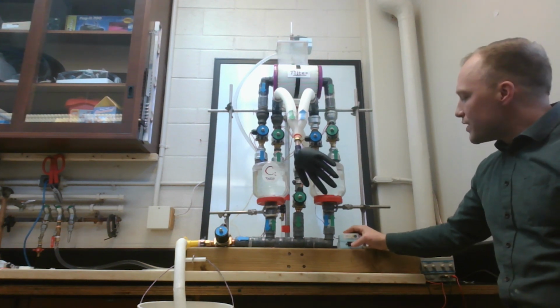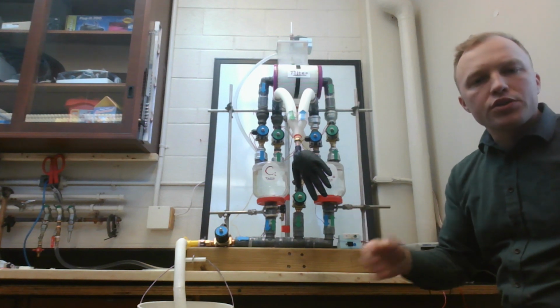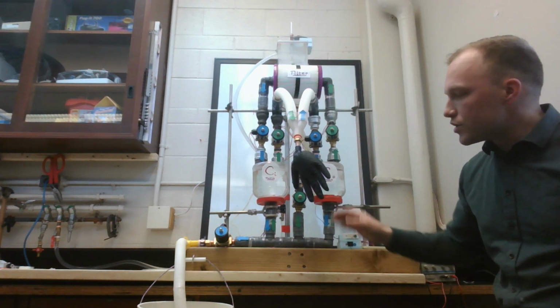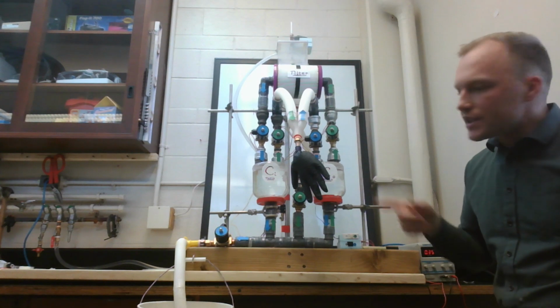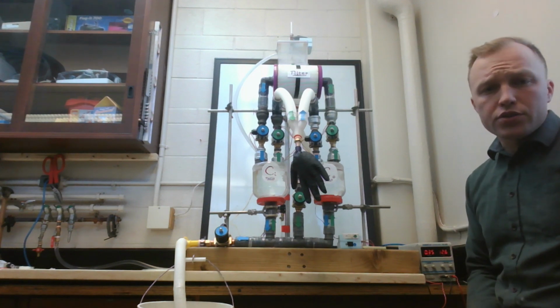Now, this system is a little bit slow. It's slow because the diameter of these pipes is restricting flow. So at 1.25 inner diameter, these actually aren't enough. We need a larger diameter plumbing system to increase the flow rates. Additionally, some of these solenoid valves are actually restricting flow a little much. So we need a higher flow, lower pressure solenoid valve.